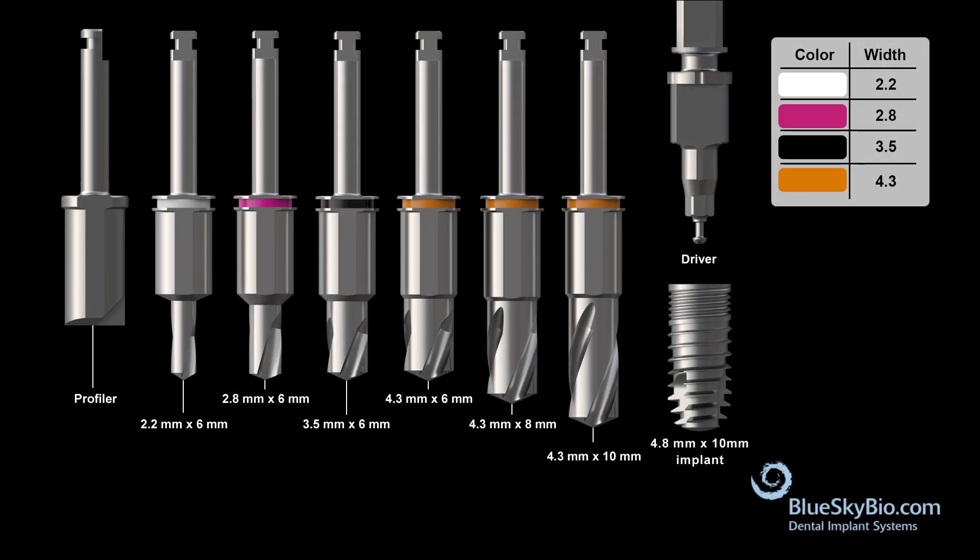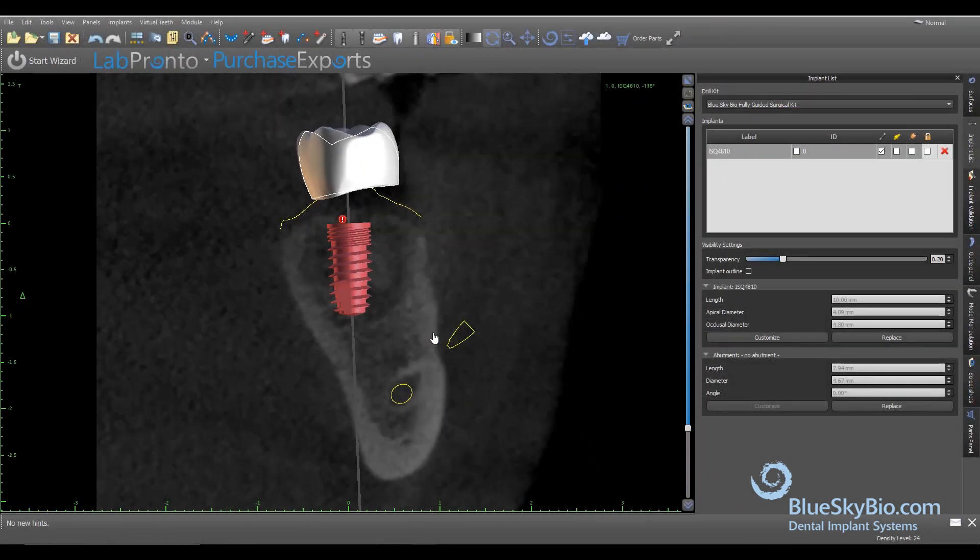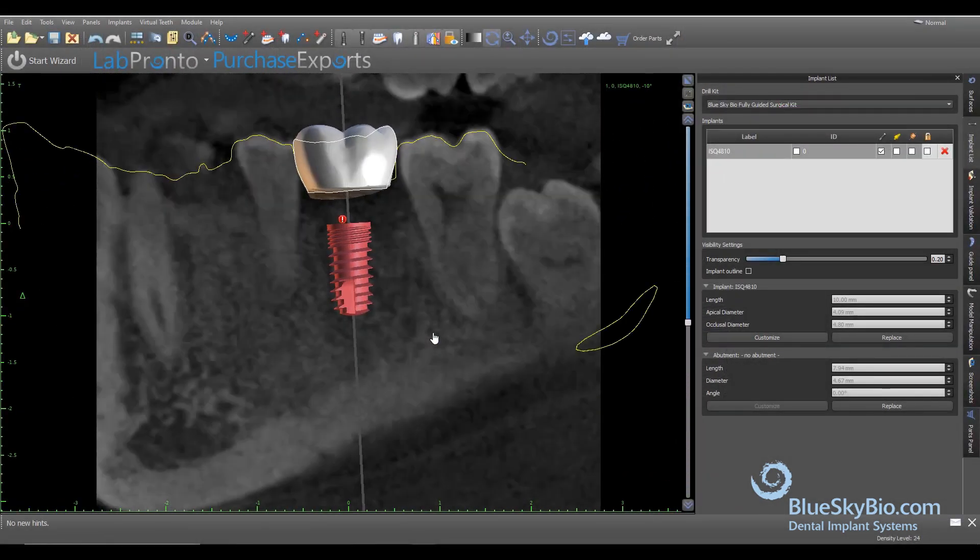The Blue Sky Bio fully guided keyless kit is a simple, ideal solution for guided surgery that offers maximal ease of access by eliminating the surgical keys. Virtually position the Quattro implant in the best restorative and surgical position.